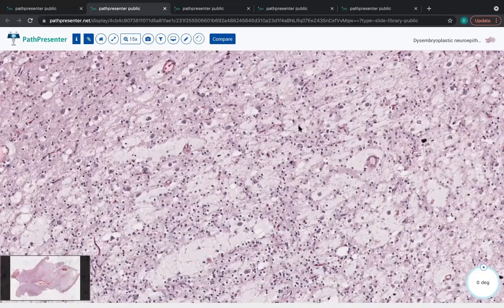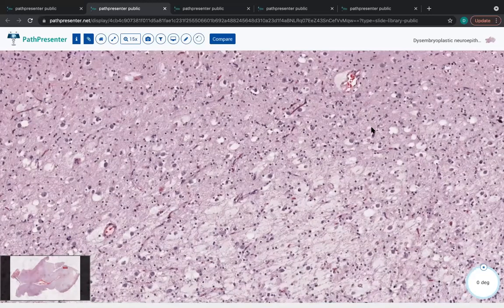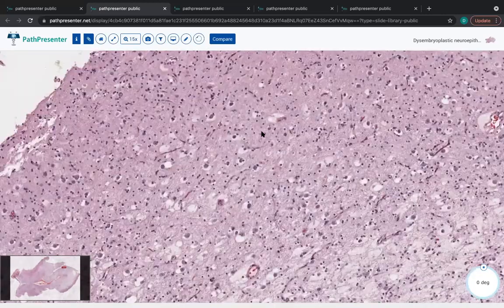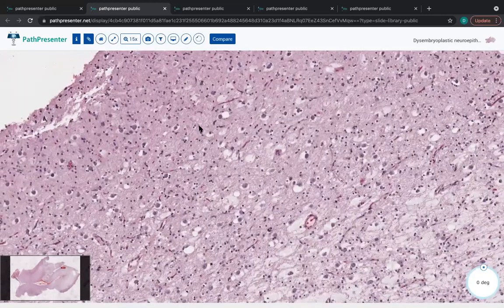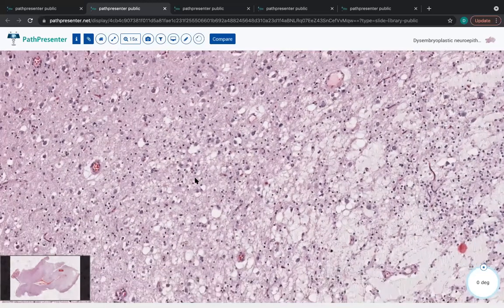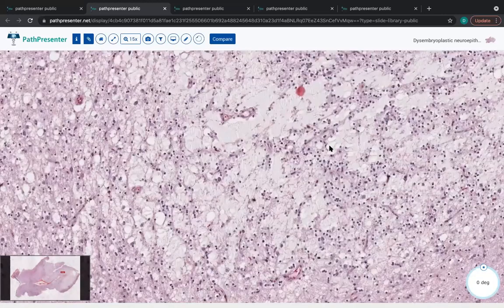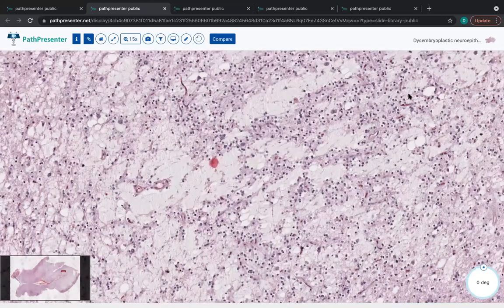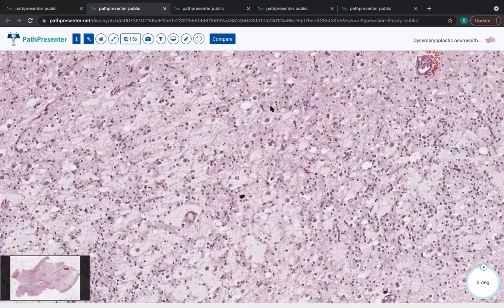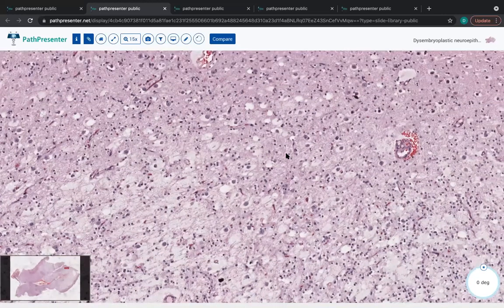Usually these are WHO grade 1 tumors. Again, there are some other low grade diffuse gliomas that can have somewhat similar morphology. So this is always a consideration in a differential that includes other entities. But for the purposes of maybe a board study or just general knowledge, this is a very classic demonstration of what these tumors look like. These tend to have FGFR1 tandem duplications of kinase domains if one has a molecular bent.